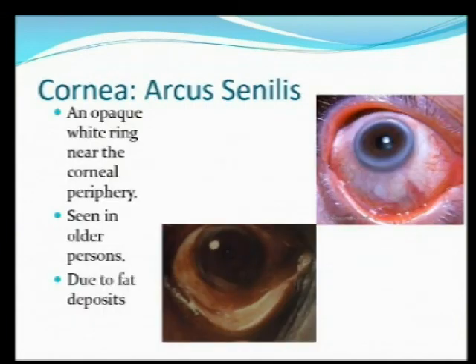All right, now here's another one in the cornea. And this is really the first one that we've come to that I would classify as unremarkable. You look at it and you get this weird bluish white ring running around their cornea. Notice that there's about 1 millimeter of clear cornea from the limbus, and then you start to see this white ring.